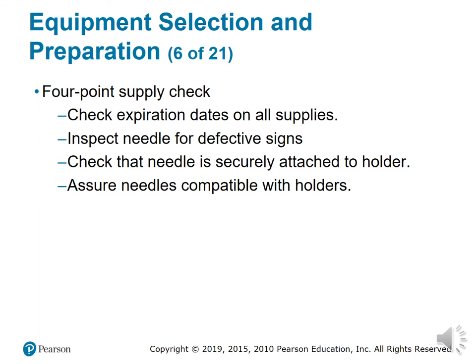All right. Four-point supply check. Check expiration dates on all supplies. Inspect needles for defective signs. Check the needle is securely attached to the holder. Assure needle compatibility with the holders.